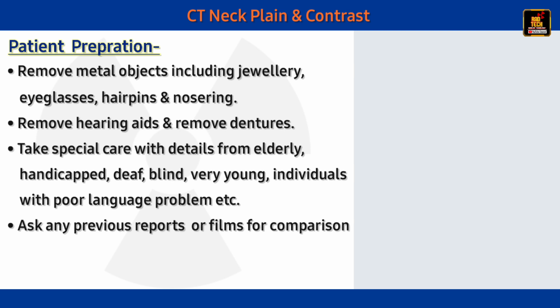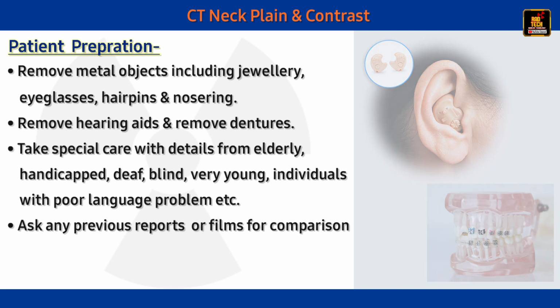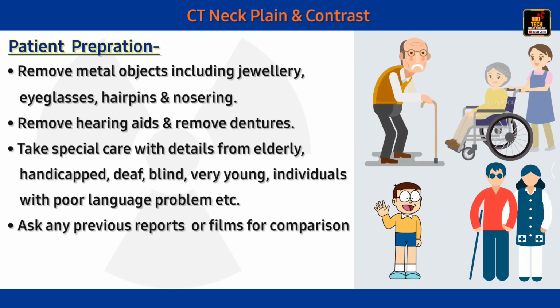Remove metal objects including jewelry, eyeglasses, hairpins and nose ring. Remove hearing aids and dentures. Take special care with elderly, handicapped, deaf, blind, very young, and individuals with language problems, etc.